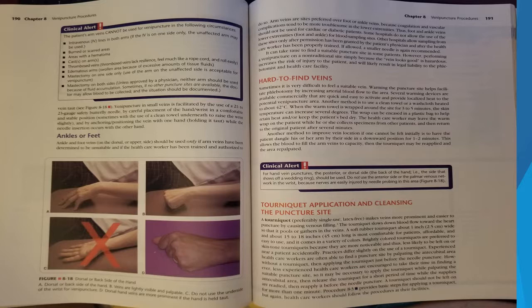Practices differ slightly on the use of a tourniquet. Experienced healthcare workers are often able to find a puncture site by palpating the antecubital area without a tourniquet, then applying the tourniquet just before the needle puncture. However, less experienced healthcare workers are encouraged to take their time in finding a suitable puncture site, so it may be necessary to apply the tourniquet while palpating the antecubital area, then release the tourniquet for a short period of time while the supplies are made ready, then reapply it before the needle puncture.